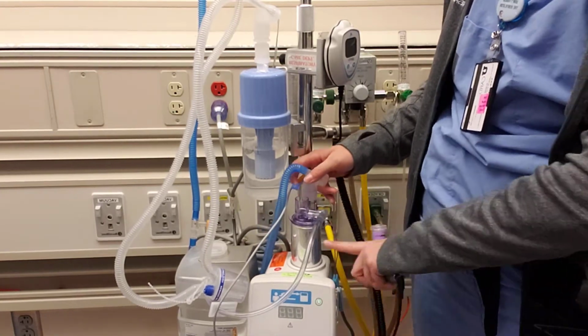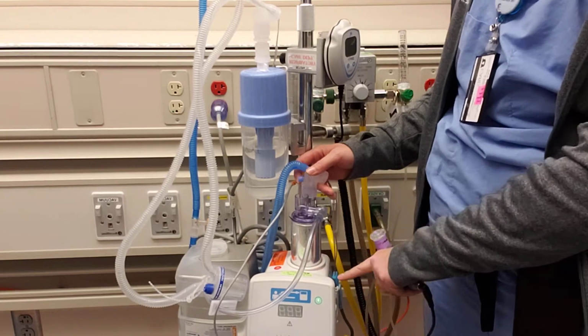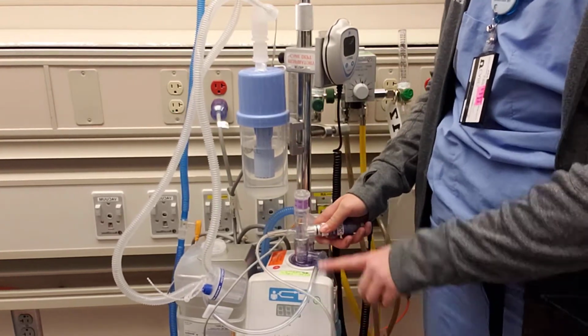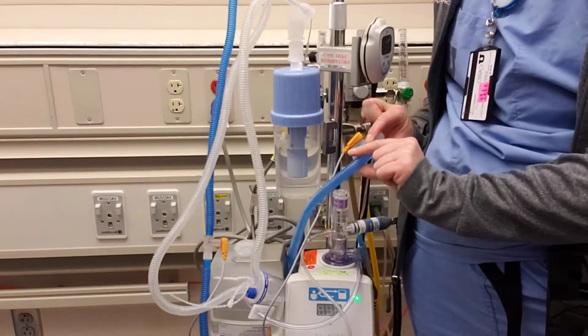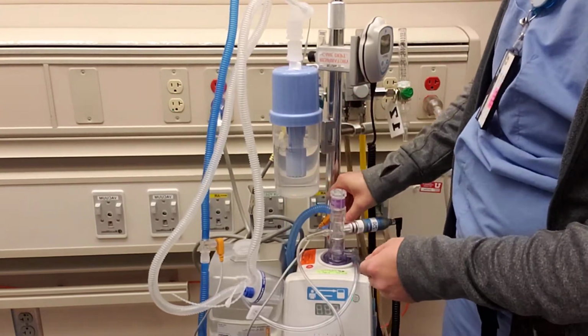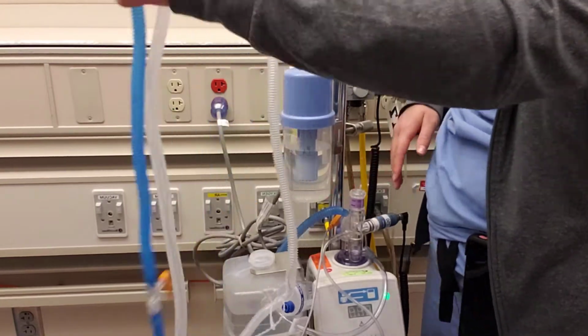Next, we have our Concha column that sits inside of our heater. Just remember, if there's any metal to metal, that's how we heat up a system. This goes in the inhalation, and then we have our blue corrugated tubing attached to the heater wires headed towards our baby.